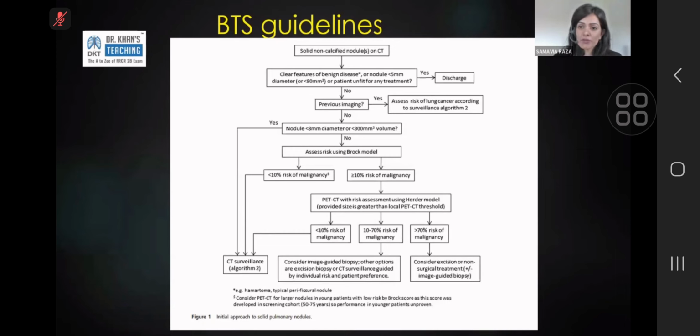What volumetric softwares do, depending on different brands, different providers, is you load the scan on that software, you click on the nodule, and it does a volumetric analysis of the nodule. Depending on the vendors, you can either edit the contours of the nodule on volumetry, or the software doesn't allow you to. Technically, the software shouldn't allow you to.